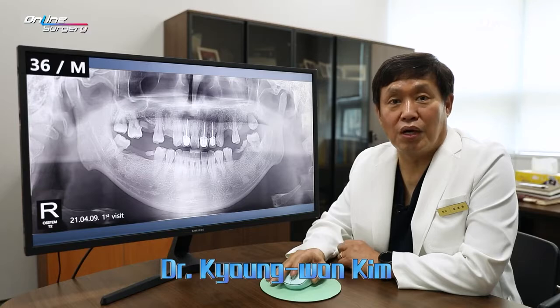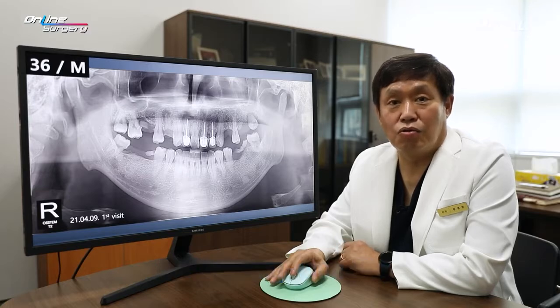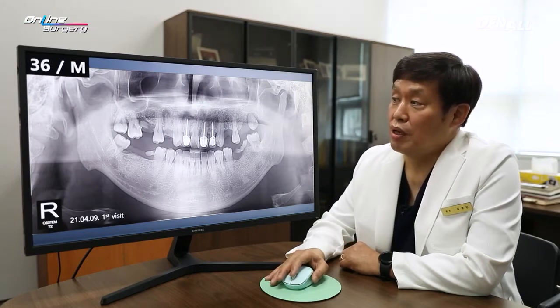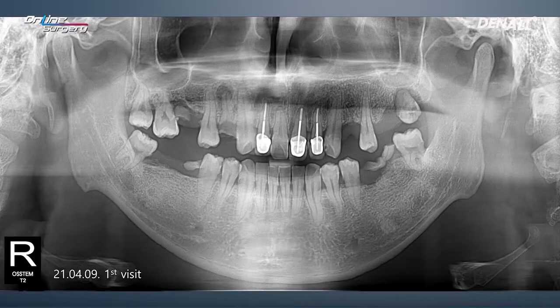Let's look at the surgical clip and review the case. The patient of the day is a 36-year-old male patient. If you look over here, this is at the initial visit. The oral condition was not very good, and you can see multiple root rests within the oral cavity.